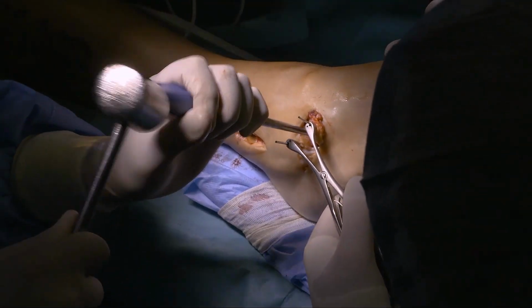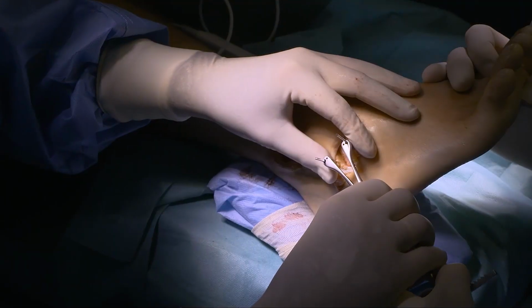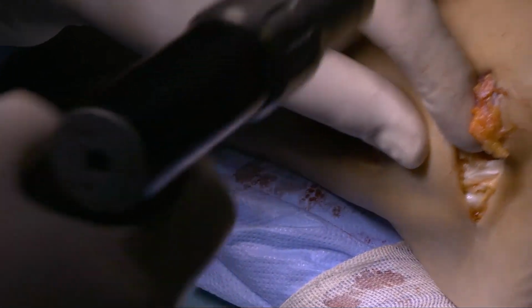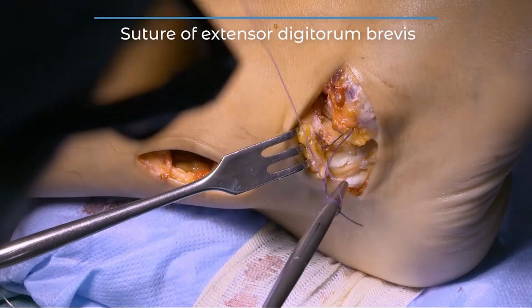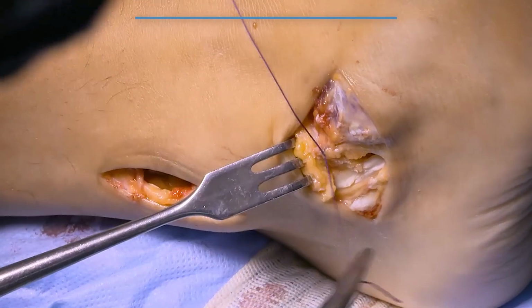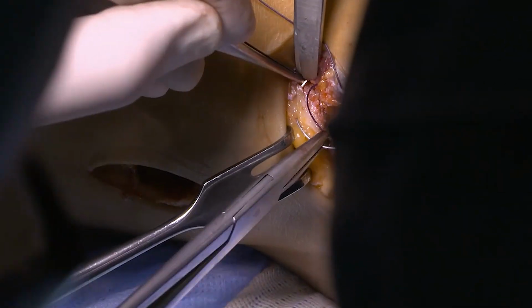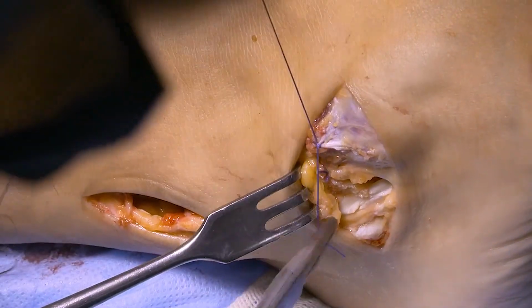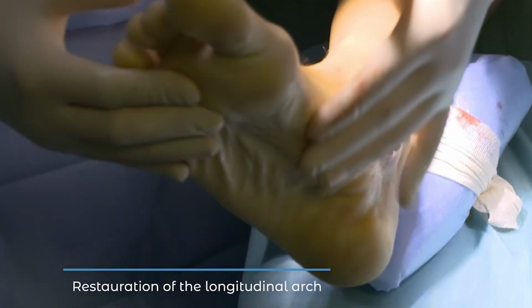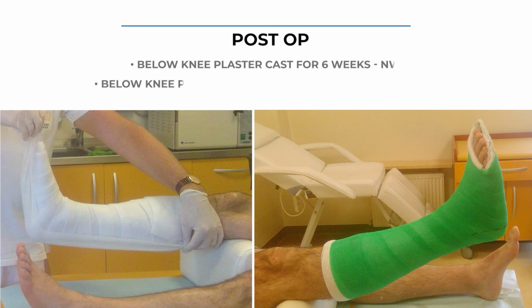After inserting the bone graft, the osteotomy site is very stable. You can make sure of this by making intense pronation and supination movements. Post-operative treatment is typical.